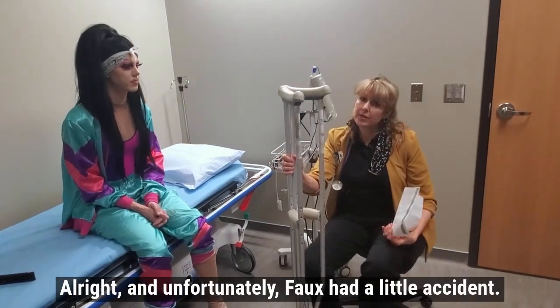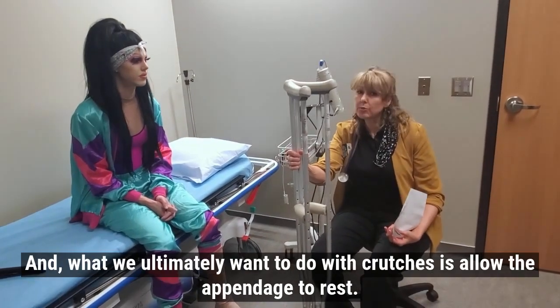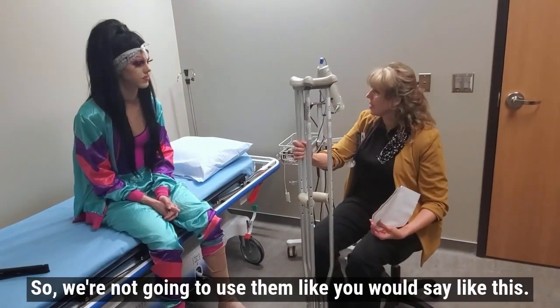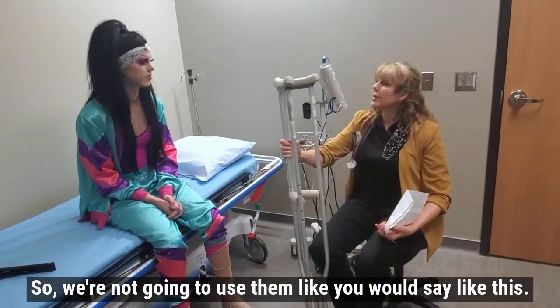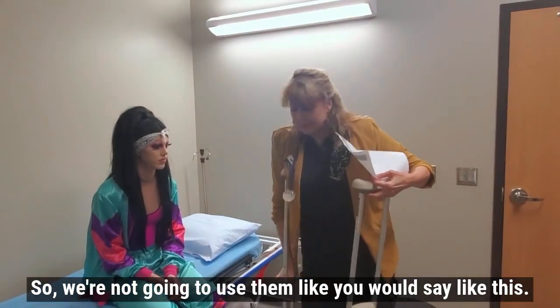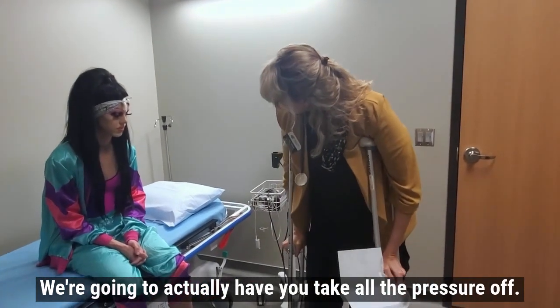Unfortunately, Pho had a little accident, so we're going to talk about using crutches. What we ultimately want to do with crutches is allow the appendage to rest. We're not going to use them like you might casually — we're going to have you take all the pressure off.